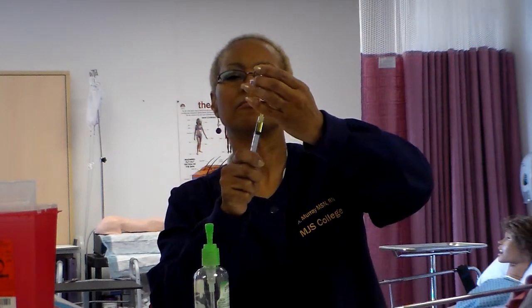Eject any air remaining at top of syringe into vial. Okay. Here we go. Remove needle from vial by pulling back on barrel of syringe.